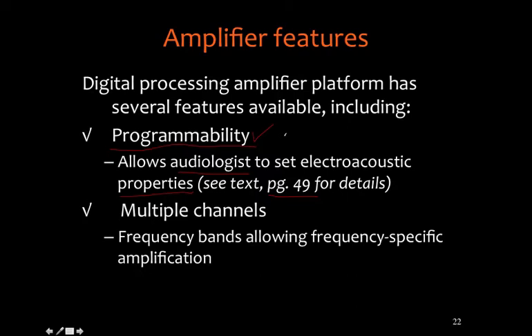The question is, do we know what the optimal electroacoustic parameters always are for a given individual? And the answer to that is probably not. We have some general guidelines and sort of general, conventional ways that we program hearing aids, but it would be a true statement to say that the capacity to have a hearing aid perform exactly as I would like it to has never been better. And again, I would generally call that programmability. That is to say, I can set a hearing aid to perform however I'd like it to.